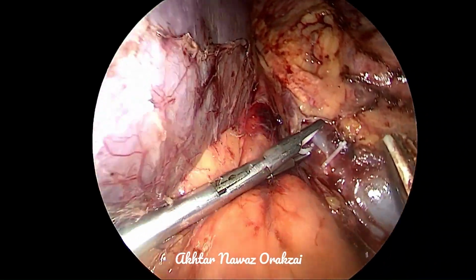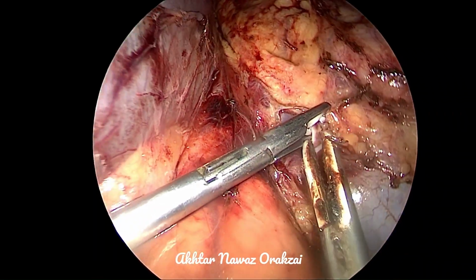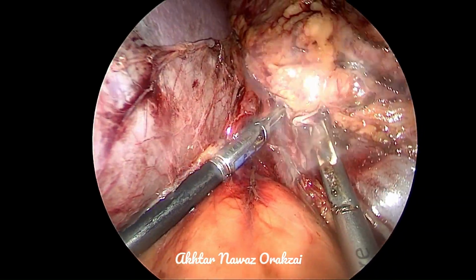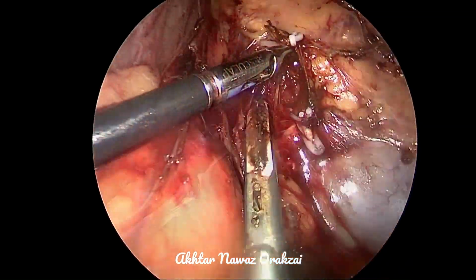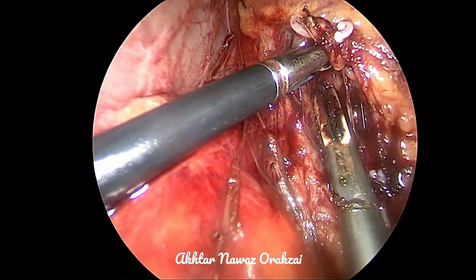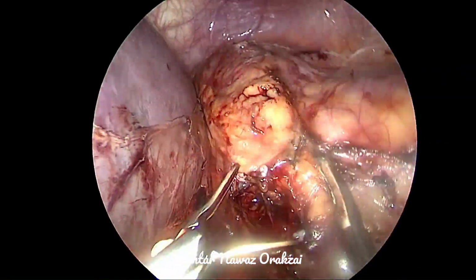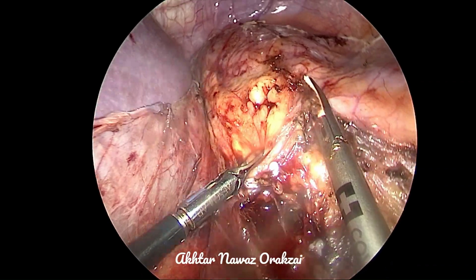After clipping this vein, we will be able to cut it, and thus the adrenal will be detached from the main vessel. This will give us confidence, as well as there are less chances of complication. Here you can see that we are going behind the adrenal now, and the psoas muscle can be seen. So the next step is to separate the adrenal gland from the upper pole of the kidney.